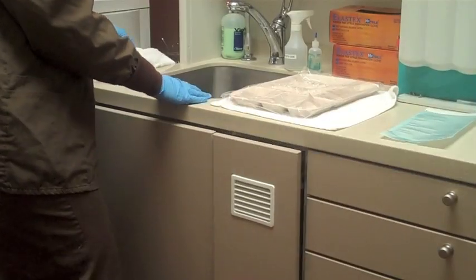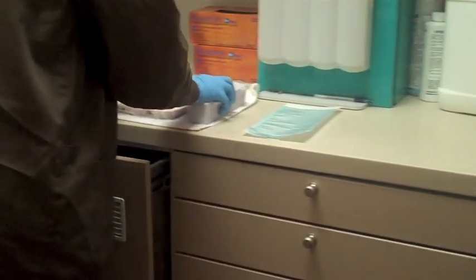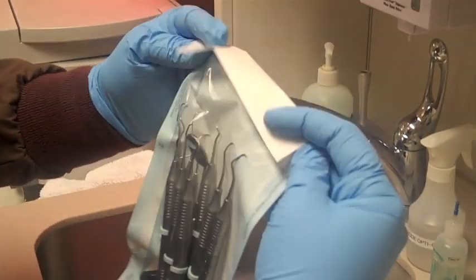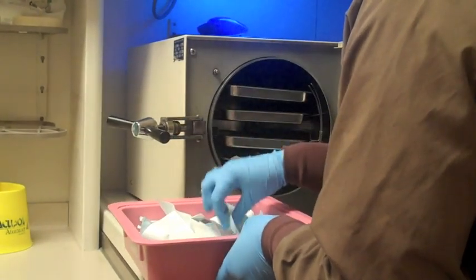Once the drying cycle has been completed, the basket is then removed and the instruments are placed into a sterilization bag. Those instruments, which are in the bags, are now placed into an autoclave, which is the actual sterilizing unit.